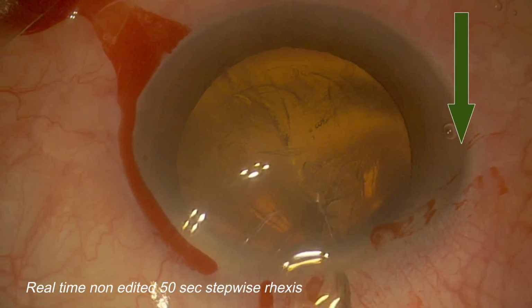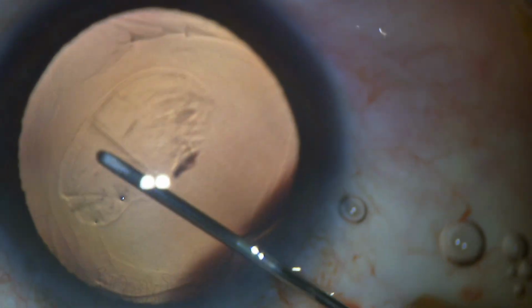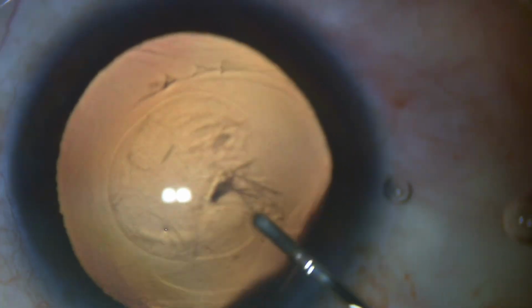And here, what would happen if you think of it like a circle? You will always try to bring the flap towards the center of the eye with direct rotation to the center, and this will definitely end up with a very small capsulorhexis.